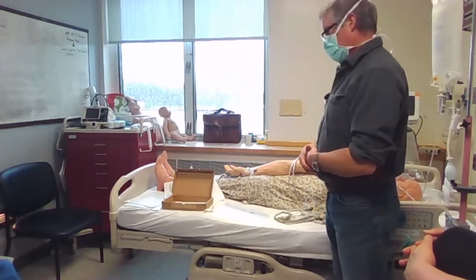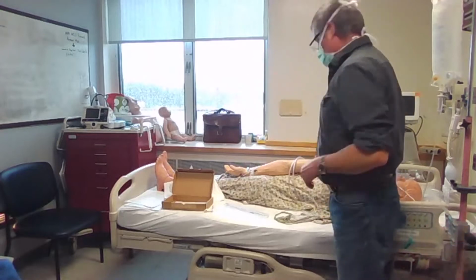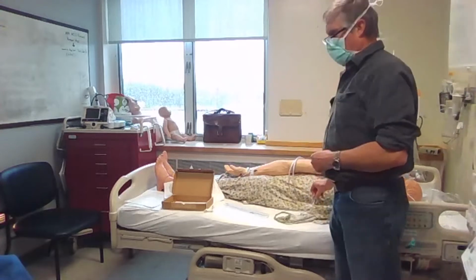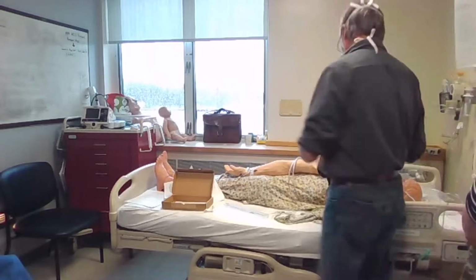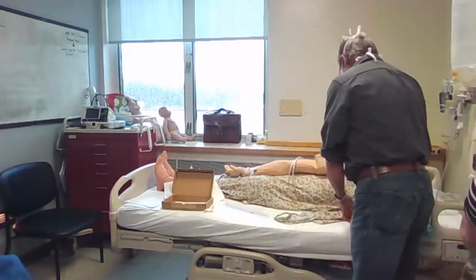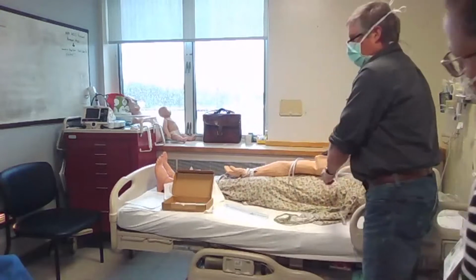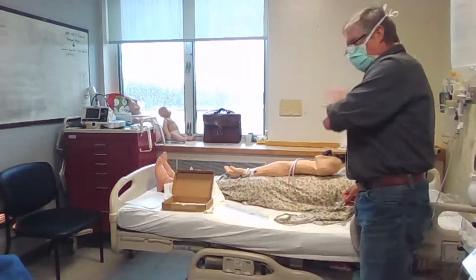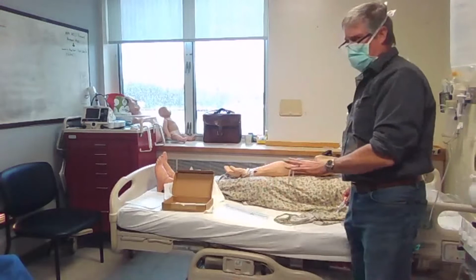So do you just hold it there, zero it, and then it can go wherever it wants after that, or do you have to hold it and tape it there? So for every 15 centimeters this goes up or down, it's going to have a corresponding up or down in the blood pressure that you see on your monitor. So it needs to stay in a stable place. What I do a lot in a trauma situation or a code situation is I put it here, I tape it to the arm loosely, if you don't want to constrain the arm, and I zero it right there, and then it's with the patient no matter what happens. And it's going to be the most accurate thing you got.